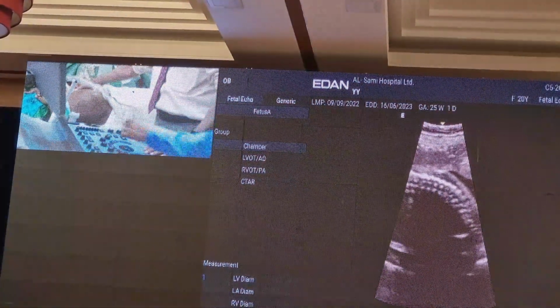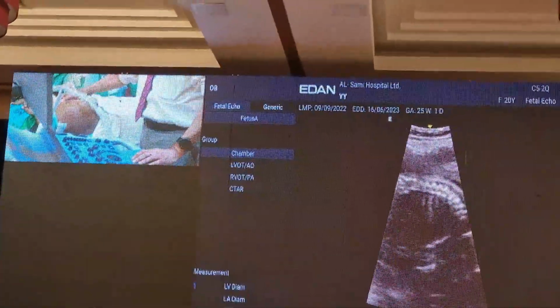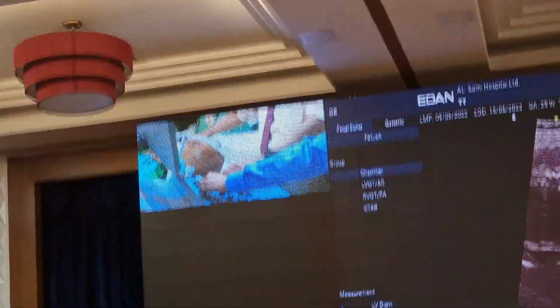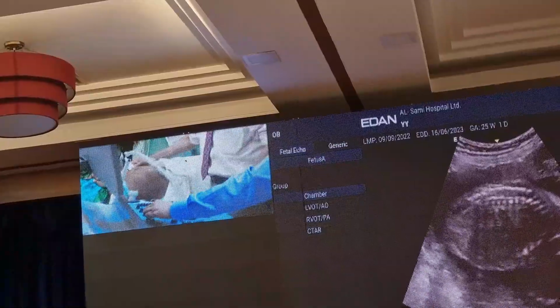Okay. So there is a spine. This may be slightly older, and therefore very often you get a lot of shadowing coming from the spine and ribs, but that's the ductal arch. The ductal arch is typically, as I said, a wide arch.